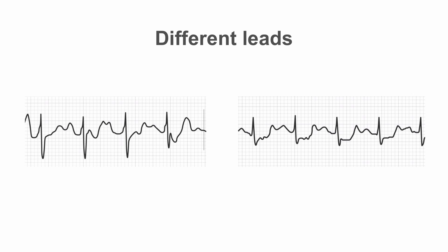We have to keep in mind the idea of contiguous leads when looking for ST segment depression. For example, if we think there's some ST segment depression in lead I, we're going to go ahead and look in AVL. If we think there's something going on in V5, we're going to look at V6 and V4. So looking at neighboring leads can be helpful.